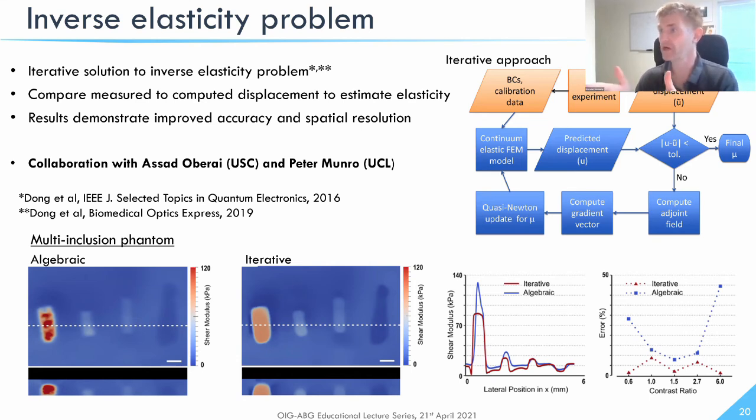So over the time that we perform our imaging, the viscoelastic effects are quite low, so we may have a slight inaccuracy in our elasticity because we don't know where we are on that creep deformation curve. But within the acquisition time, there won't be too much variability of viscoelasticity. So in that way, we're only really concerned with absolute contrast, so it doesn't affect us.